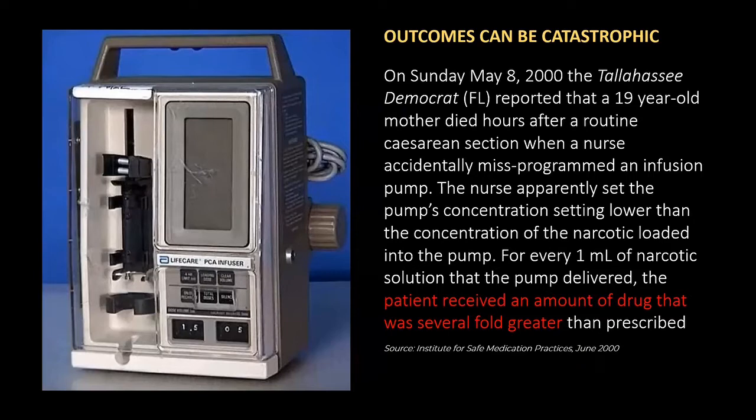Of course, there are icons. For instance, we're doing a development at the moment, which is going to be used in developing countries in Vietnam. Now, there are up to 14 different languages there, so we're developing an icon set that people can use and understand without the problem of trying to do the graphic identification of different languages. So it's not a hard and fast rule that you can't develop your own icons, but you've got to have a good reason.